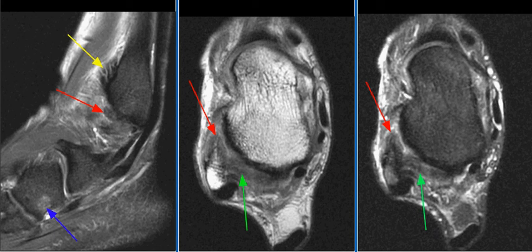The anterior talofibular ligament is best assessed on axial images at the level of the distal lateral malleolus. In acute sprains or partial tears, the ligament may be thickened and is of increased signal intensity with adjacent fluid or hemorrhage acutely, with blurring of the margins of the ligament.